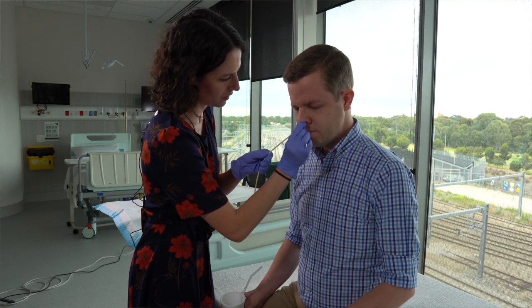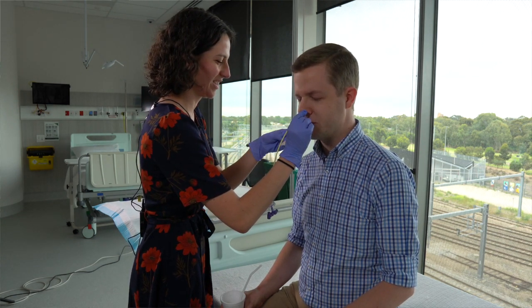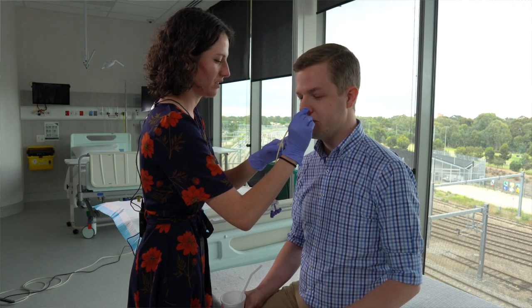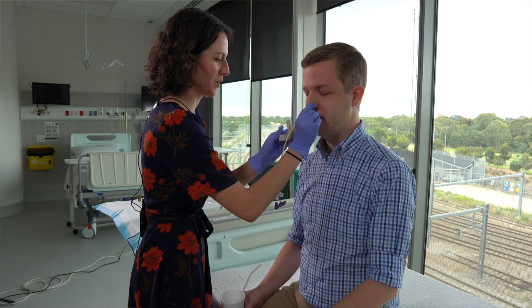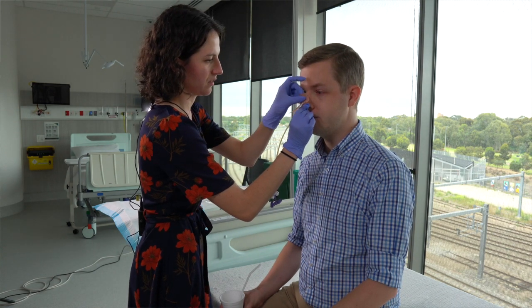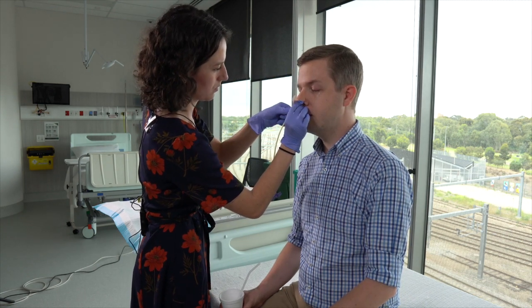Once you've reached the target length, check the patient's discomfort. Then secure the NET to the nose using the adhesive dressing. The guiding wire must remain in situ until it has been cleared for use. Once the NET has been secured to the nose, you can attach the end of the NET to the patient's clothing using a safety pin or adhesive tape, which hasn't been done in this particular video.